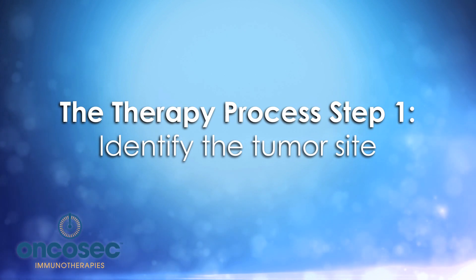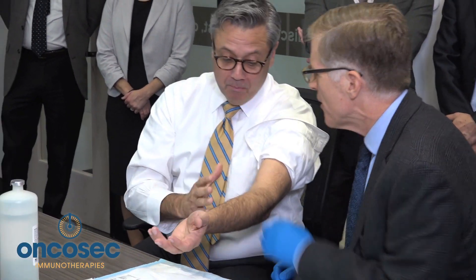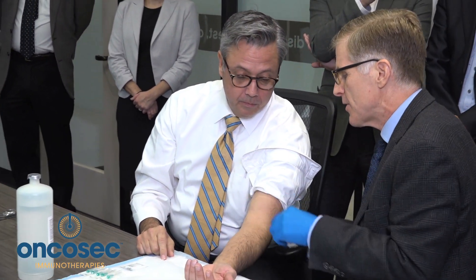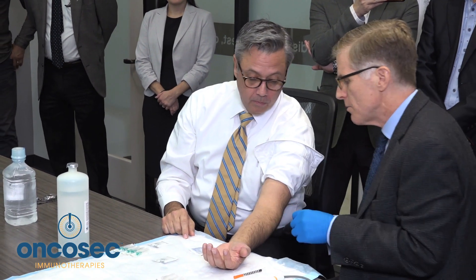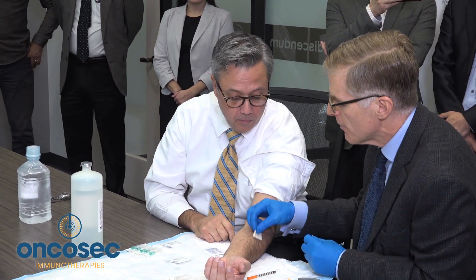First, I'm going to look at the tumor site. Dan, where's your tumor? Oh, there's one right there. We're going to treat this mole. Normally this would be melanoma, but for demonstration we'll use a mole right here.